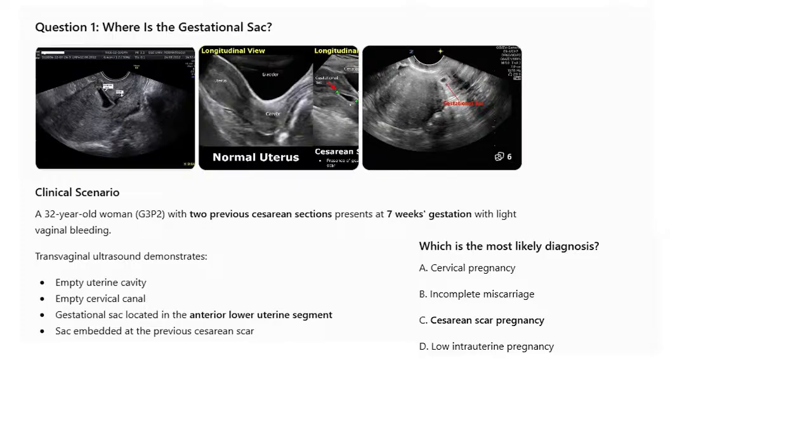D. Low intrauterine pregnancy. So these quiz questions are just meant for revision to enhance on what we have done in the lecture. So it's not an examination, but just an enhancement lecture so that you master what we have just done.